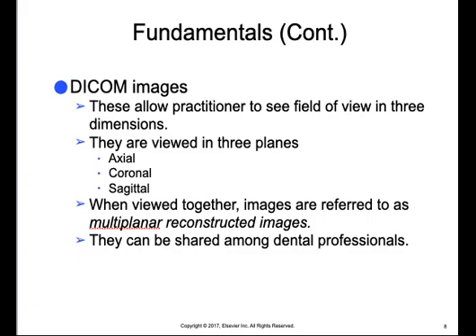And when viewed together, these images are referred to as a multiplanar reconstructed image, or an MPR. One of the advantages of using DICOM data is that images can be shared among dental professionals, such as imaging centers and other referring physicians.